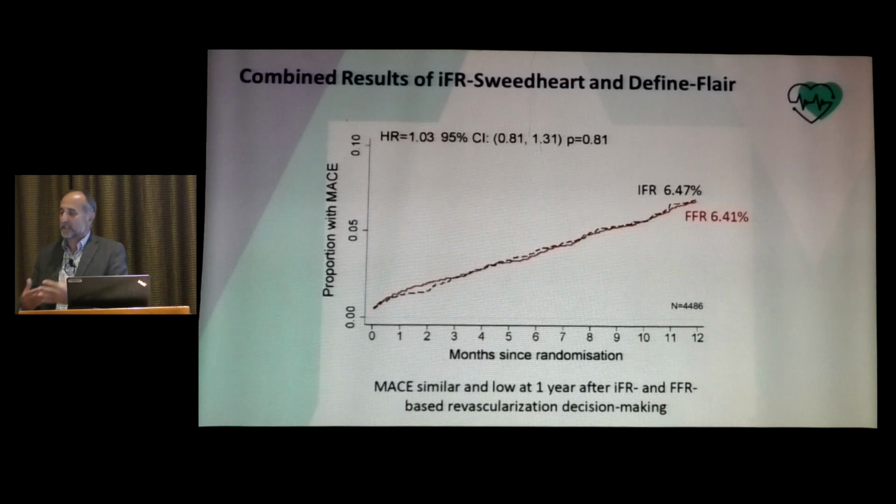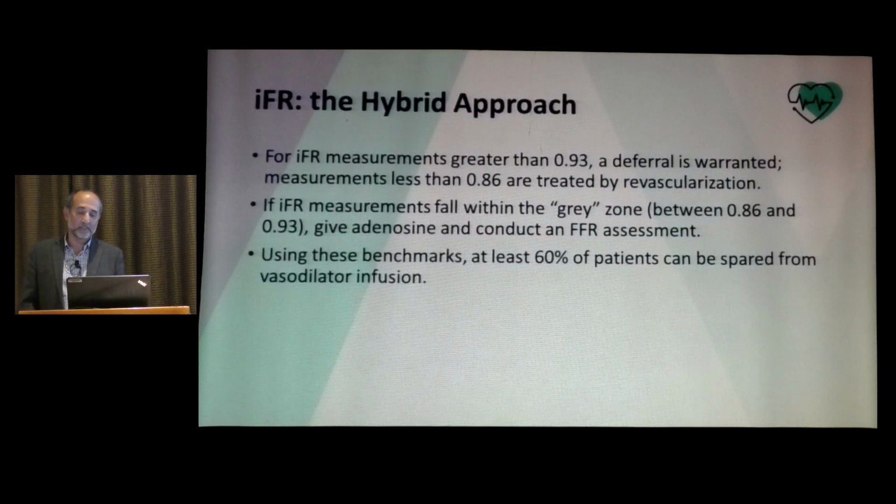So indicating that iFR is not inferior to FFR in assessing lesions, which is reassuring because this is a new technology, and any new technology, in order to prove its worth, has to prove at least that it's not inferior to an older technology. So iFR was not inferior.